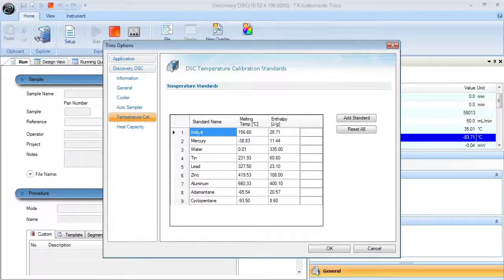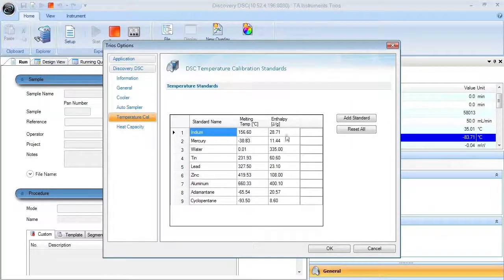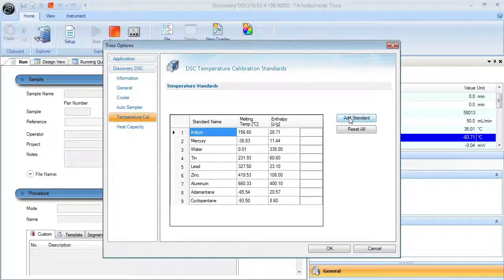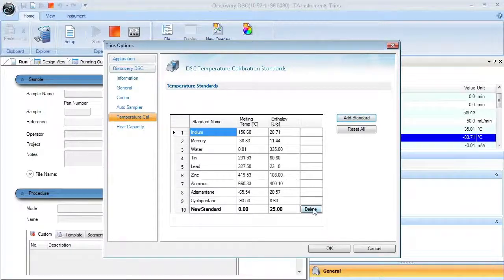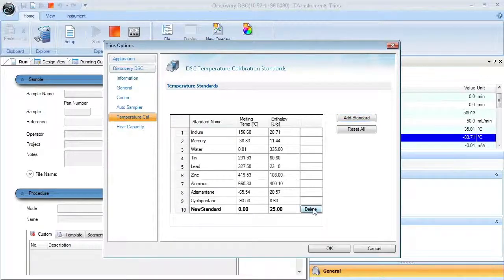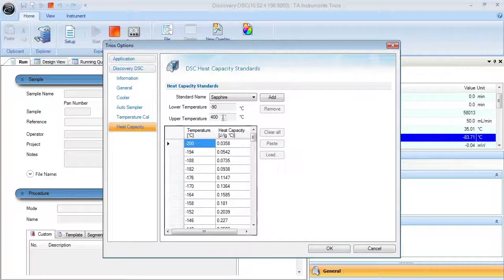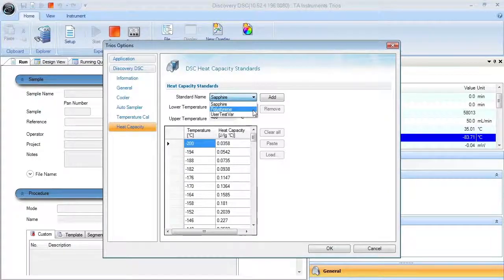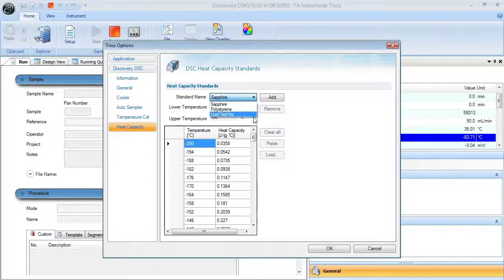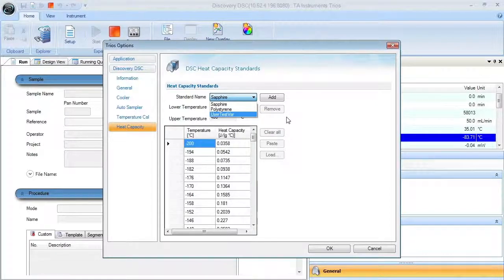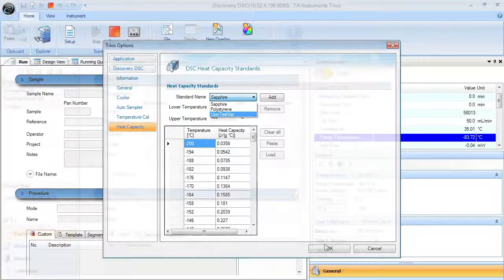The temperature tab has a list of potential temperature and enthalpy standards with the capability to add a new standard. Then the CP Heat Capacity tab contains literature values needed for calibration of two standards, sapphire and polystyrene, with the capability to add another reference material such as water.